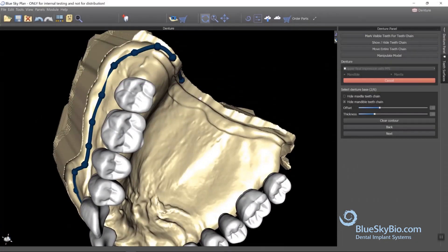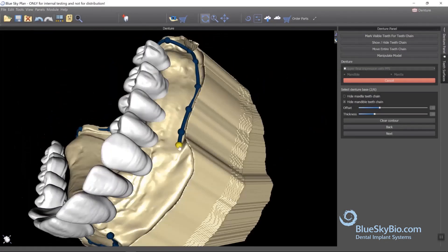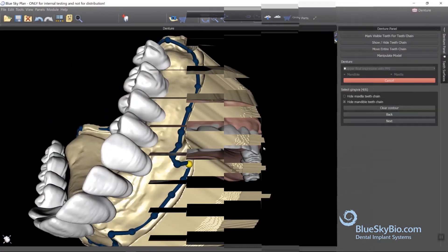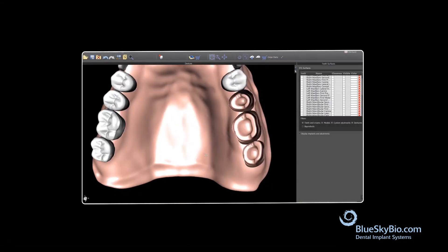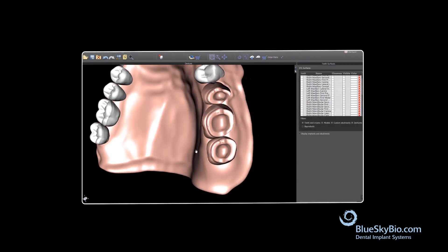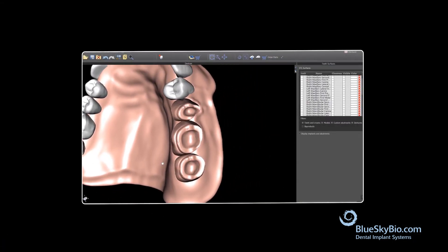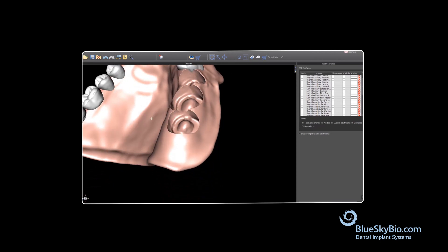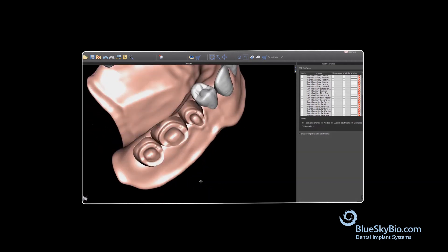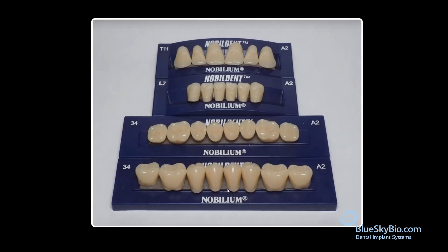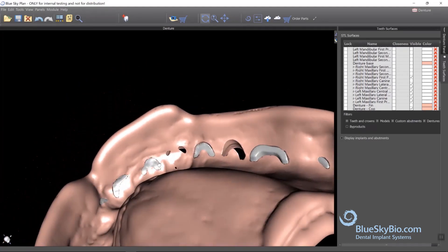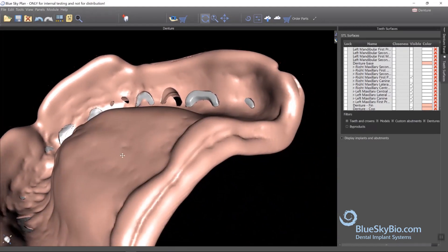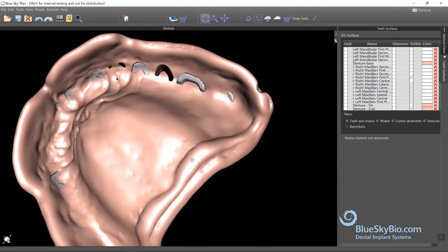The denture module can be used to create a complete denture base with teeth, a denture base with the teeth subtracted for the printing of the gingival base and placement of manufactured denture teeth, or the creation of a tooth reduction coping for proper trimming of manufactured denture teeth.